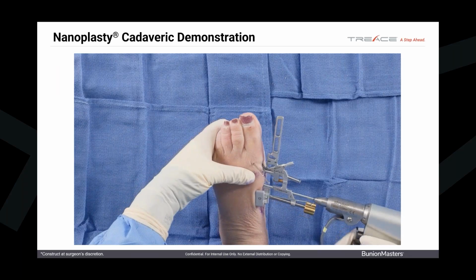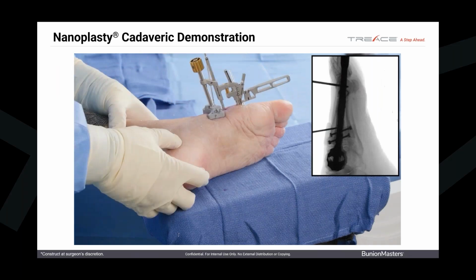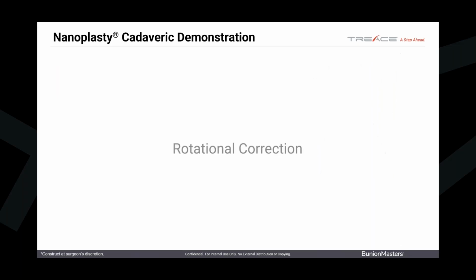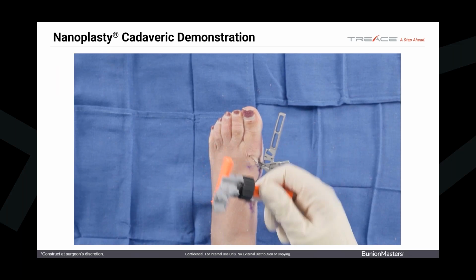Once we have this down, we'll put our tail tack in. That will actually hold our plate in position. Now our plate is secure, so it won't distally migrate with our manipulations. We're going to put our control rake on right now, and it's going to go right on the jig.